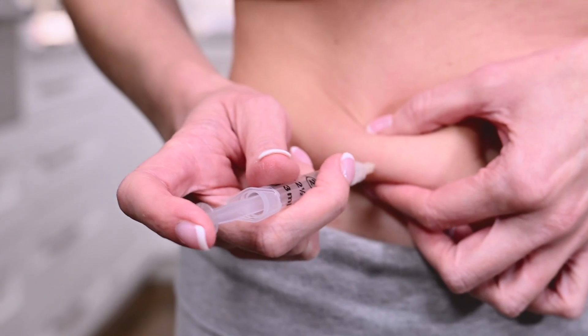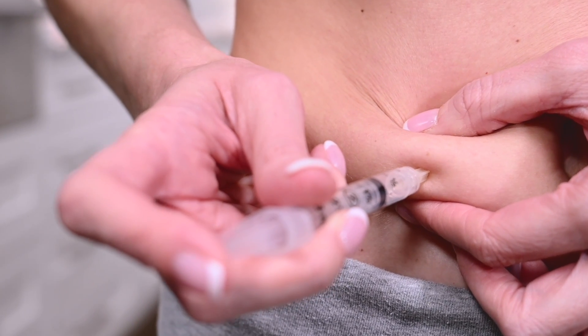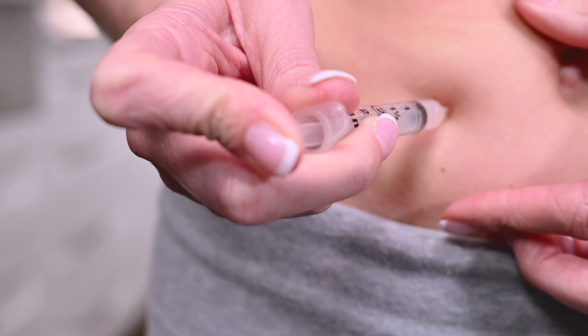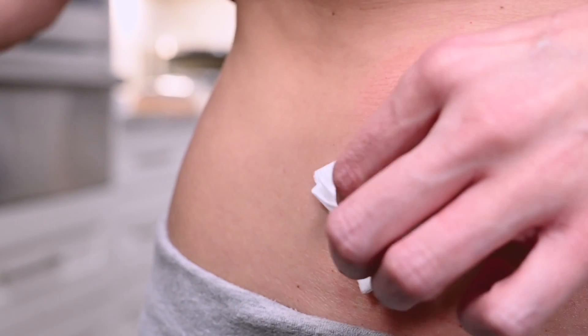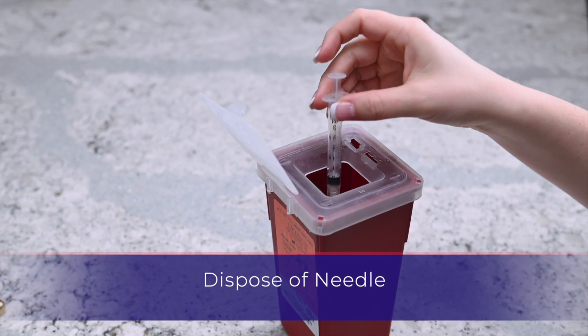Take the syringe in your preferred hand. Pinch a fold of skin between your fingers and insert the needle at a slight angle. Release the skin after the full length of the needle is inserted. Push the plunger until all the medication is administered into the injection site. Gently remove the syringe and apply pressure with gauze. Dispose of the used syringe into the designated sharps container.